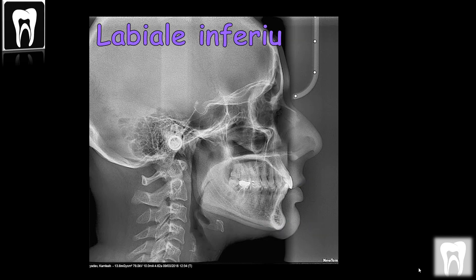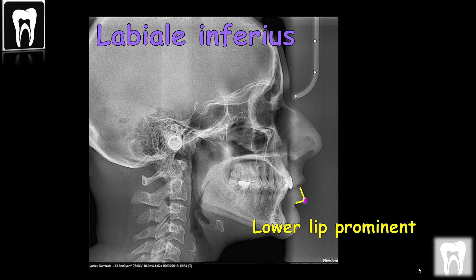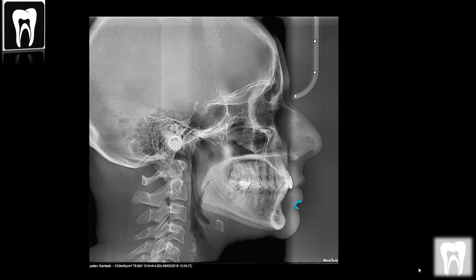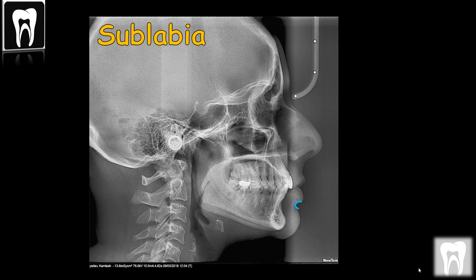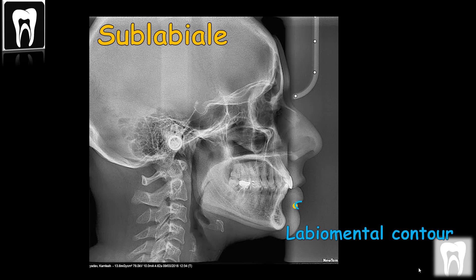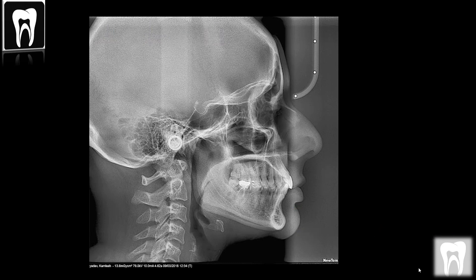Labial inferius is the midpoint of the vermilion line of the lower lip, the most prominent point of the lower lip. Sublabial is the most posterior midpoint on the labial mental soft tissue contour that defines the border between the lower lip and the chin.